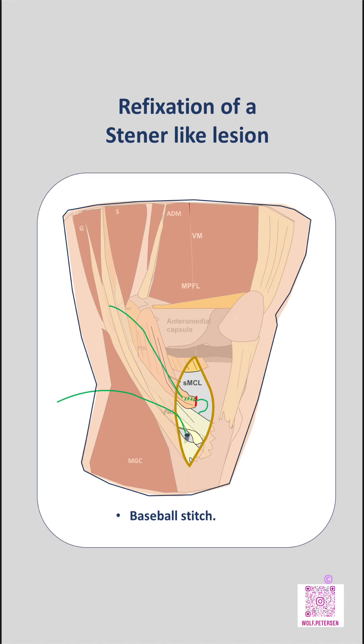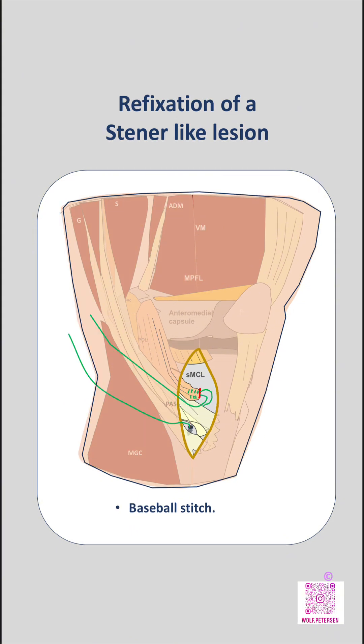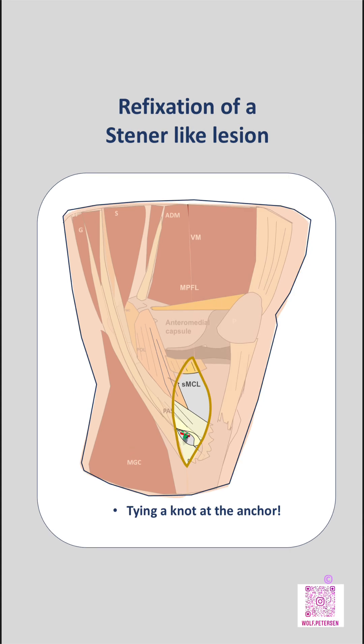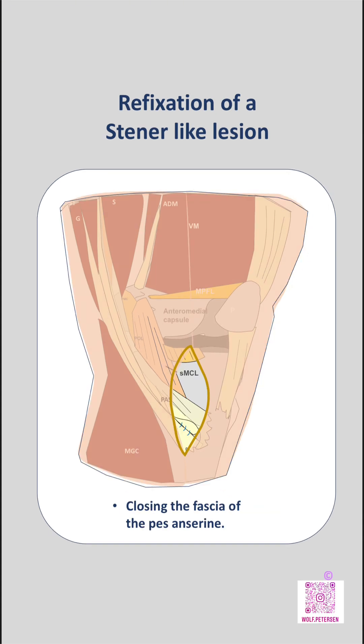After completion of the baseball stitch, the reinforcing suture is passed back underneath the gracilis tendon toward the anchor site. The suture limbs are then tied at the anchor, refixating the SMCL stump deep to the hamstring tendons and restoring its anatomic position on the tibia. Finally, the pes anserinus fascia is closed.